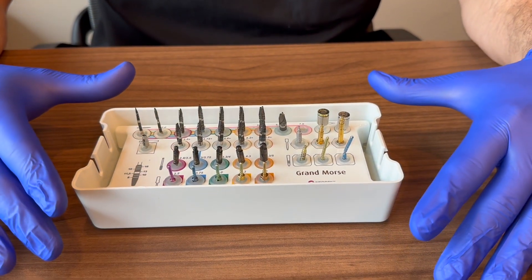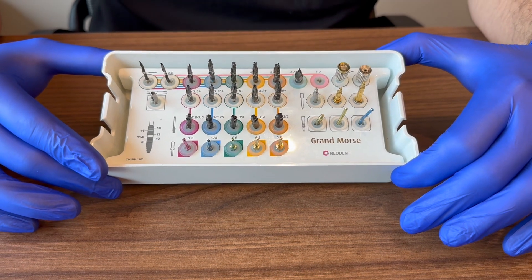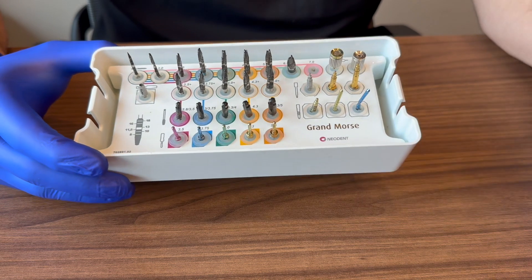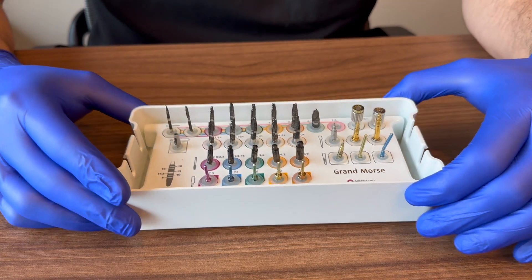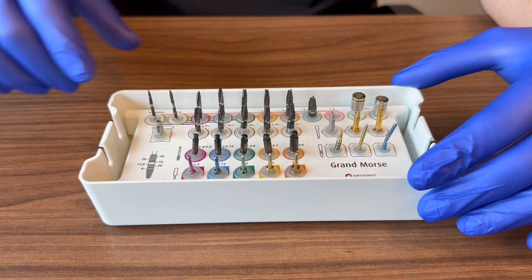We're going to go over the Neodent surgical kit — for those placing implants and even for those who aren't, because sometimes you may need to open this kit out of necessity. We'll go through what's in here, what we use most of the time, and how to use it when needed.